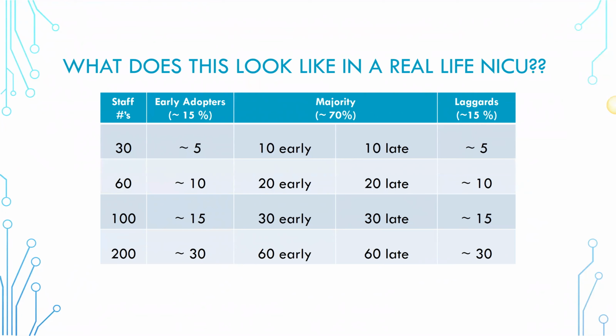So regardless of what kind of sensor you use, and there are many sensor options on the market, from cups and discs that our neurology colleagues use to needles and peel and stick hydrogels, it's really the same steps that we go through each time. We choose the site, so using the measuring tape. We then cleanse the skin or prepare the skin if we're going to do hydrogel. Then we apply or insert the sensors, look for our impedance, making sure it's quality. And quality impedance means less than 10 kiloohms, and then secure your sensors so that they don't fall off.